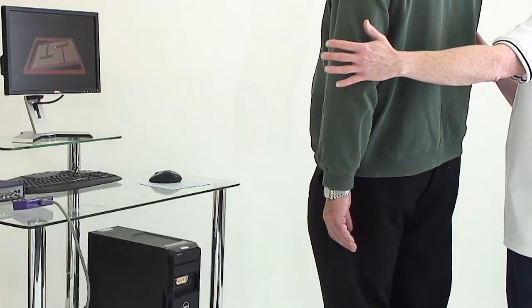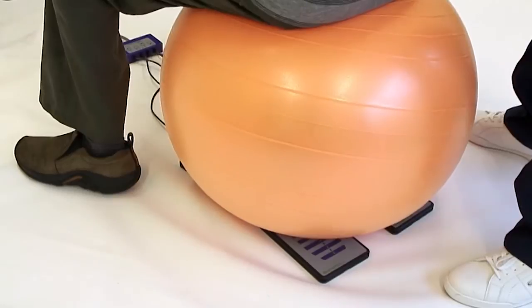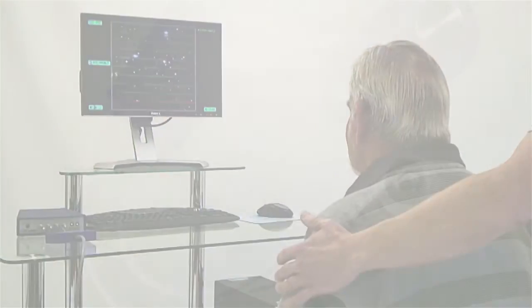Removed from the base frame, the force plates can be used on a chair for seated balance exercise, or with other equipment to accommodate functional goals.